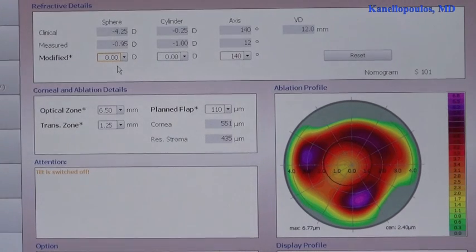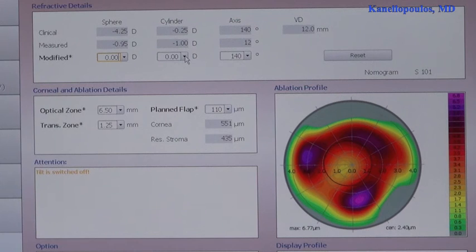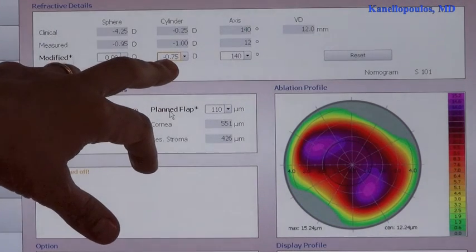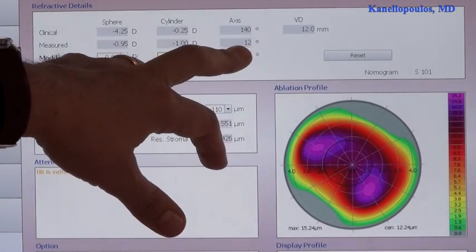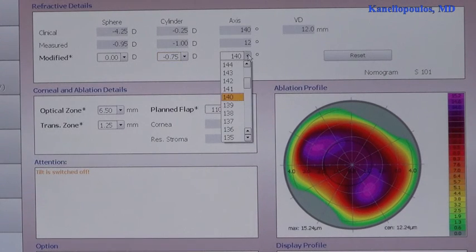So, now, we will jump to correct the astigmatism that the topographer suggests. So, I'll add to the 0.25 as a refraction. Arbitrarily, half a diopter more astigmatism. So, I'll go to minus 0.75 of astigmatism. And, I will respect the topographer's axis. So, I will jump from 140 and go to 12 degrees. And, this is a huge leap of faith.